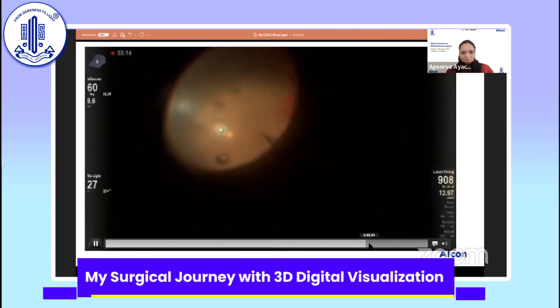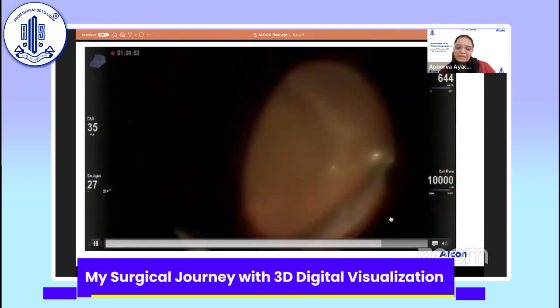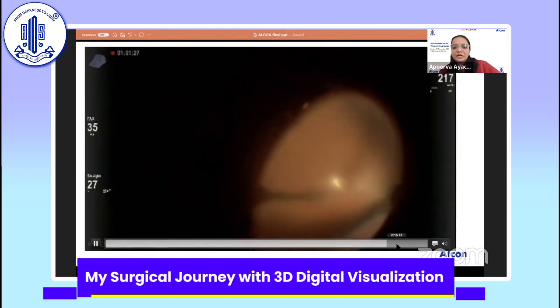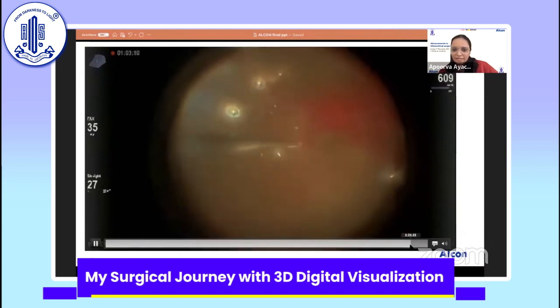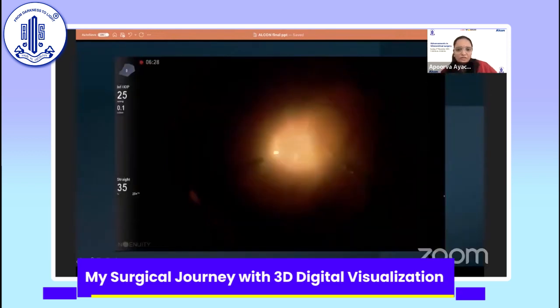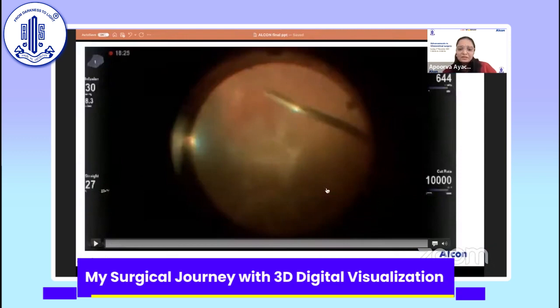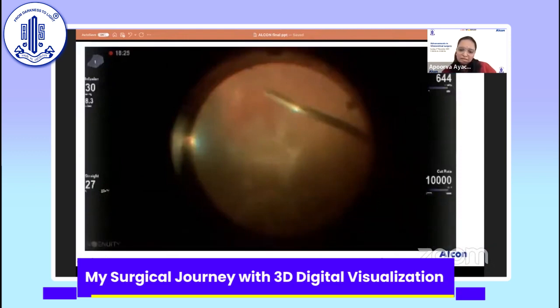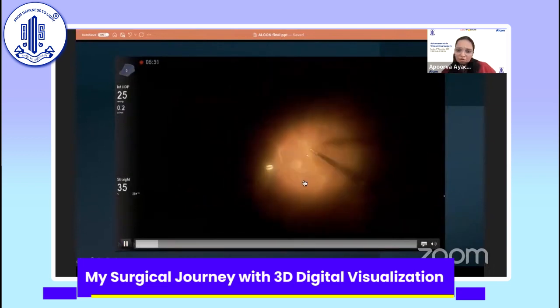This case, like I said, was relatively easy because the underlying retina still had some strength and was not weak and tearing at every excuse. So I had to make only a diathermy and settle the retina. Ultimately, this patient did very well. Or so I thought, but this was a one-eyed patient, and this patient did well for a couple of weeks. I had put oil, but she came back with under oil macular reproliferation.